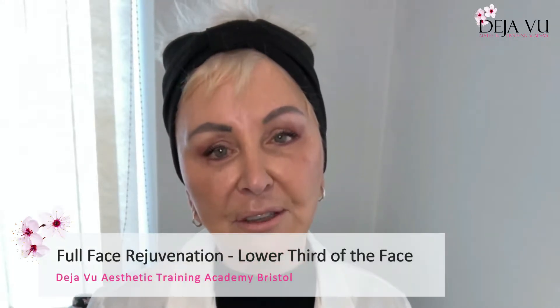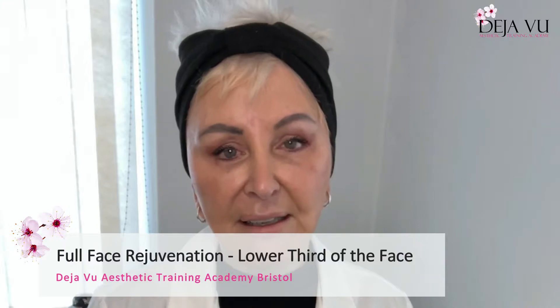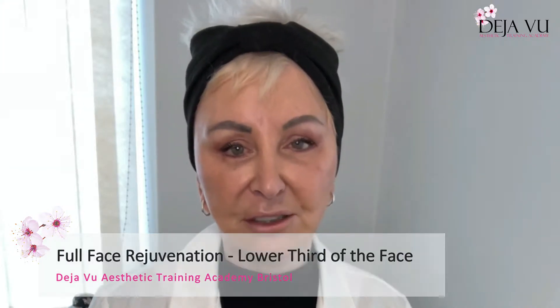Nearly at the end of our journey now, we're going on to the lower third of the face. I am the lead trainer for Deja Vu Aesthetic Training Academy and KOL for Intraline, and we are using Intraline today. The lower third is the jaw, the oral commissure, and around the chin as well. So let's get started.